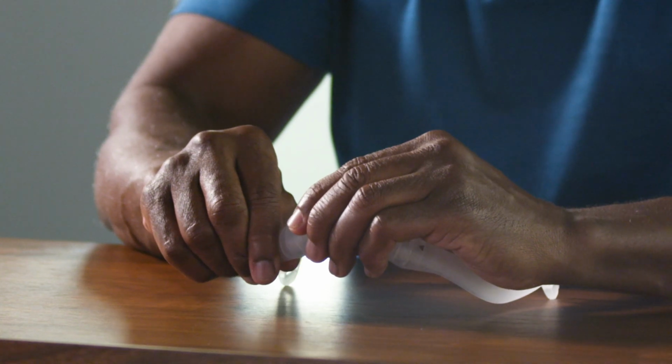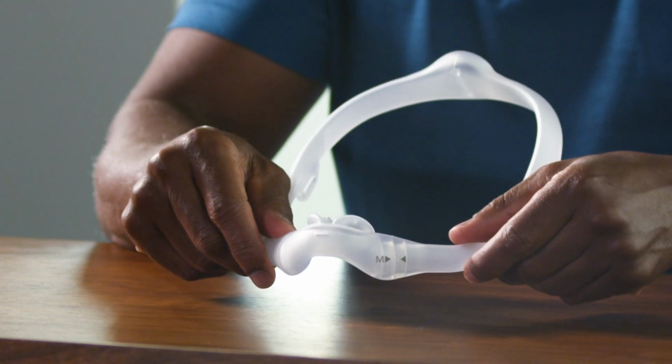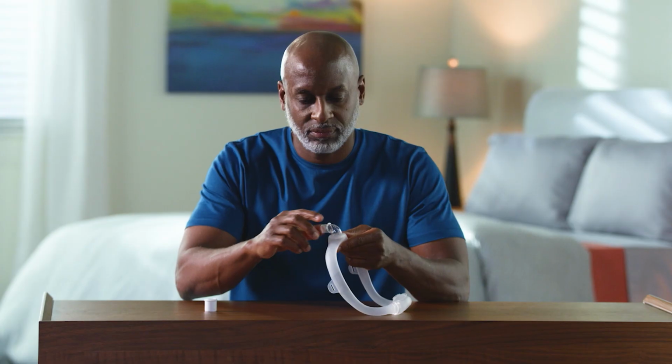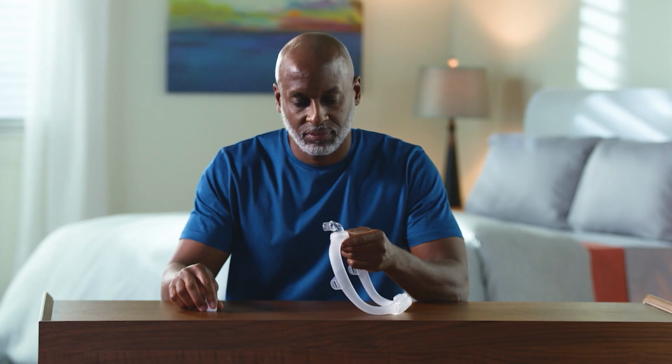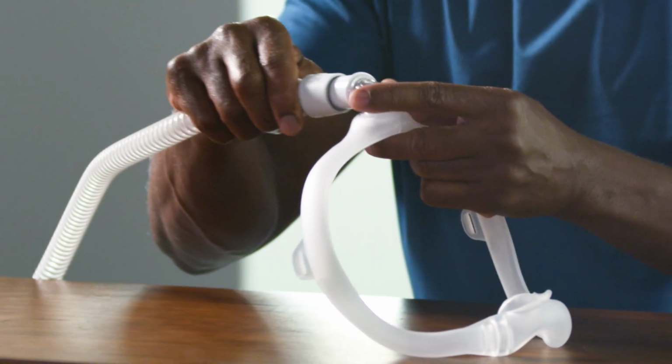Notice that the front of the cushion has a small opening. This allows exhaled air to escape and should never be covered. Now insert the elbow into the top of the mask frame. Push the tubing quick release into the elbow until it clicks into place.